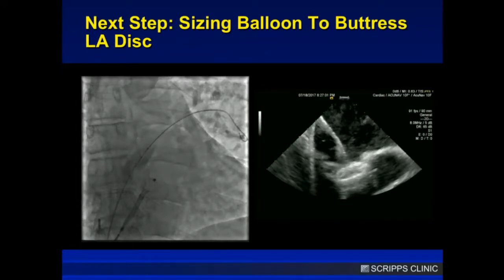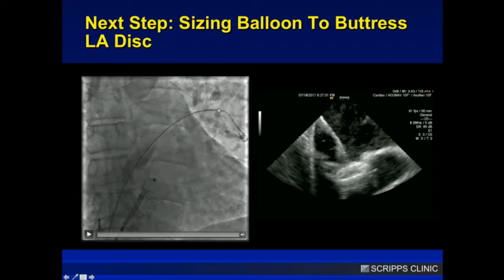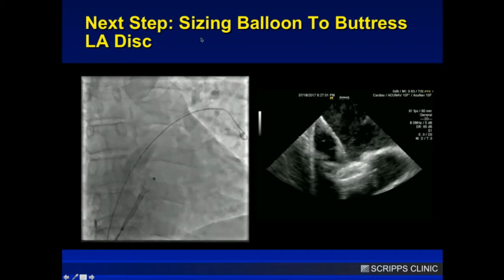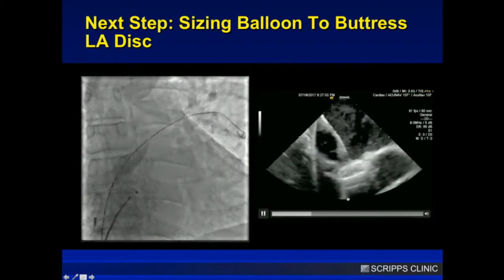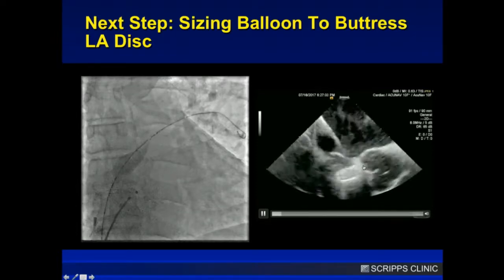The next approach is to use a catheter to prop your left atrial disc up, pushing it orthogonal to the septum. I don't usually use sizing balloons to size the ASD, but here I use a sizing balloon to help close the ASD. I got second venous access, crossed the ASD, put a wire in the pulmonary vein, and advanced a 20 or 25-millimeter sizing balloon over that wire so it straddles the interatrial septum. I inflate it to low pressure just to push that disc up, and then you can see the release.